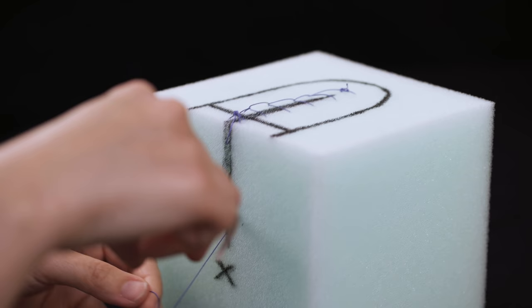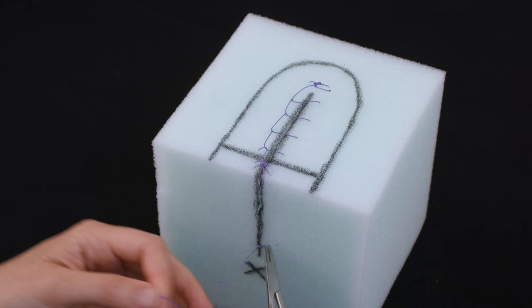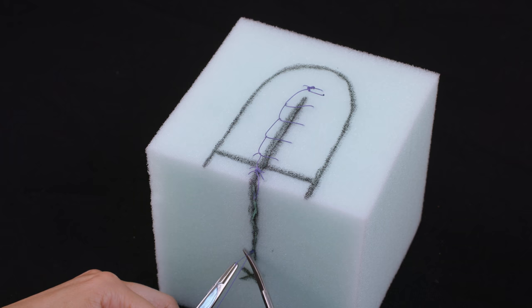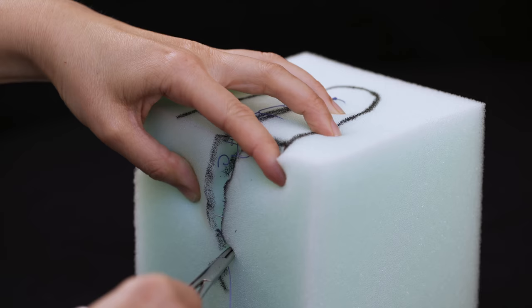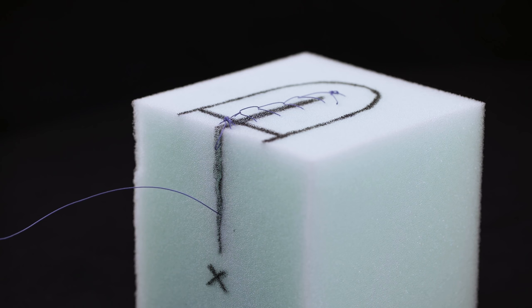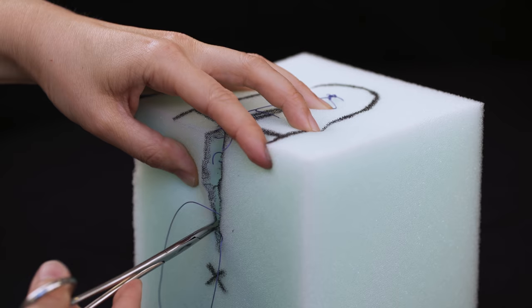Start by anchoring your suture at the end closest to the anus, then complete the skin closure using a running subcuticular stitch. I usually use the remaining 2-0 Vicryl Rapide, but 3-0 Vicryl Rapide can also be used. Since I'm right-handed, I will need to switch the needle orientation to backhand when I'm suturing on my right side and then switch the needle back to forehand for my left side.